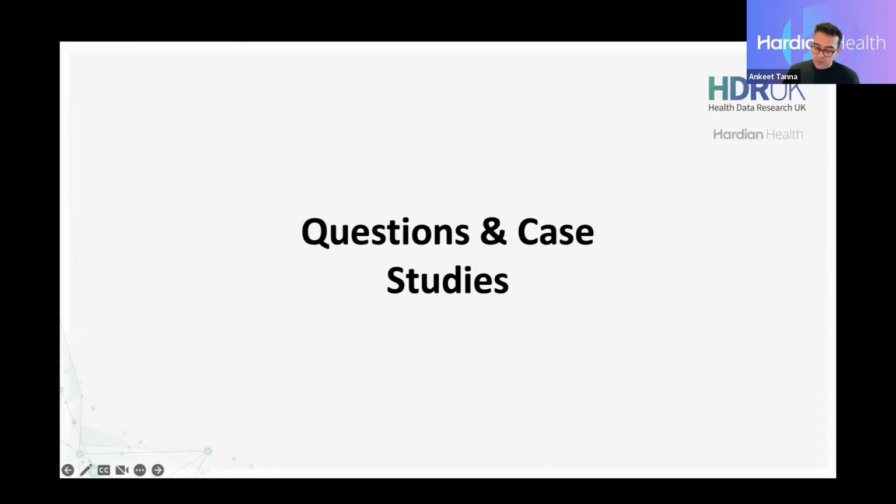That's a really, really good question, a really good point. I think there are a few answers that may explain the initial lack of what we see as adverse event reporting on, for example, MAUDE. And you're absolutely right. A lot of the adverse events that are reported are often to do with system failures rather than clinical false positives and false negatives in the case of using these kinds of AI devices.